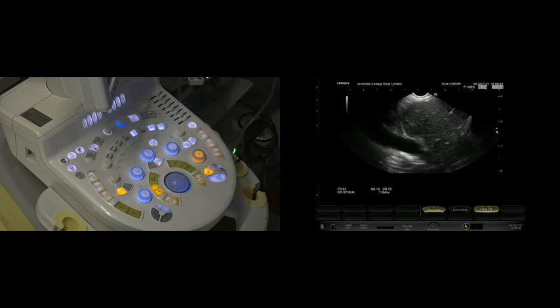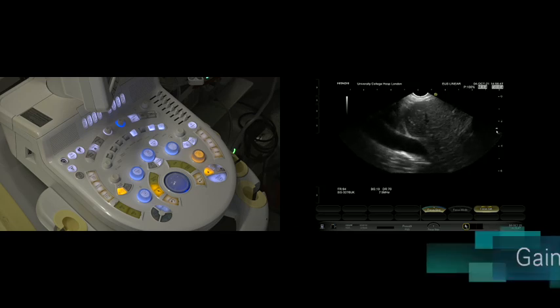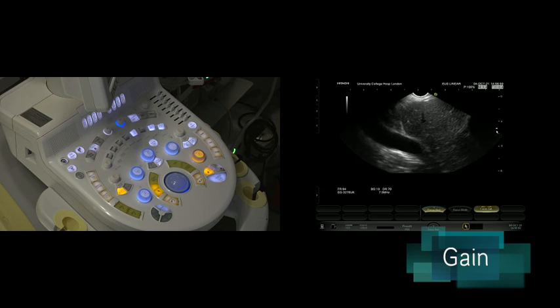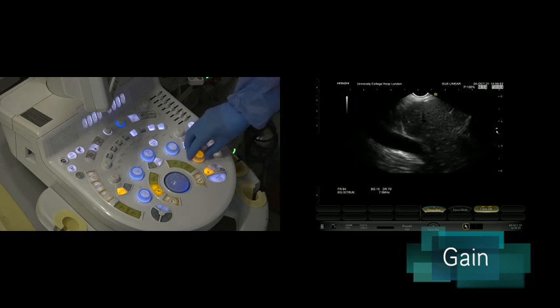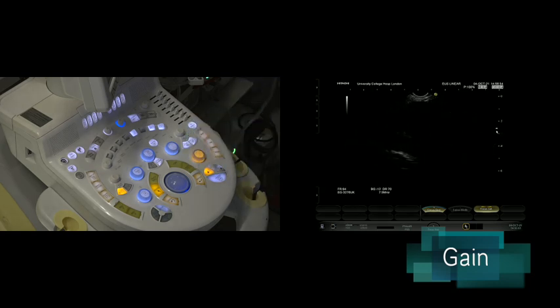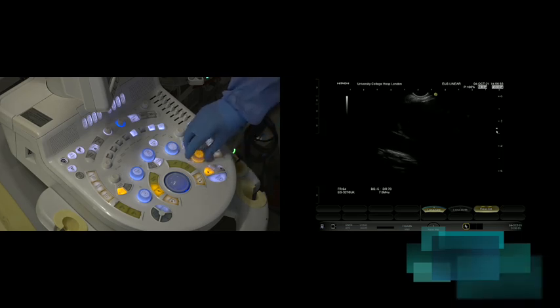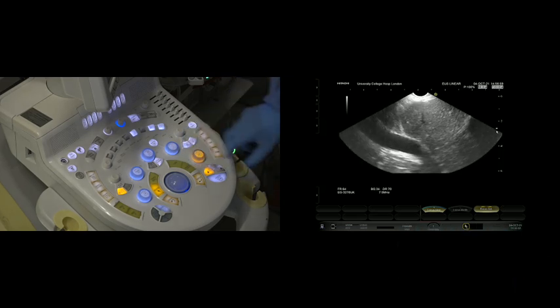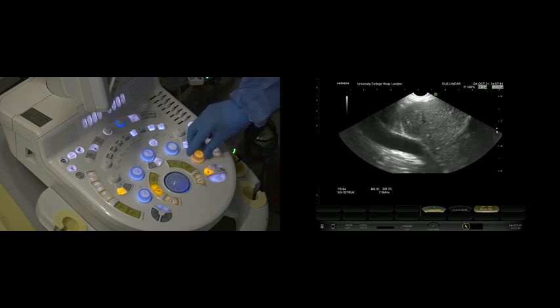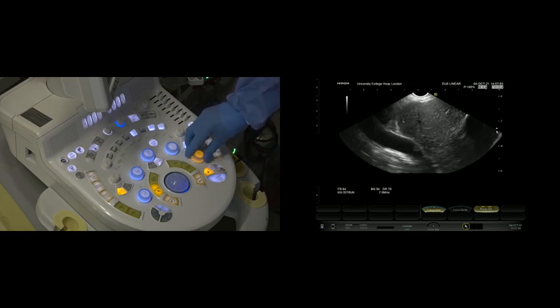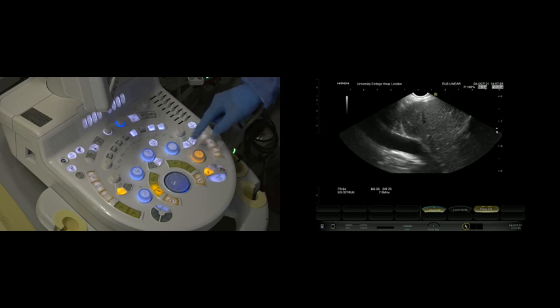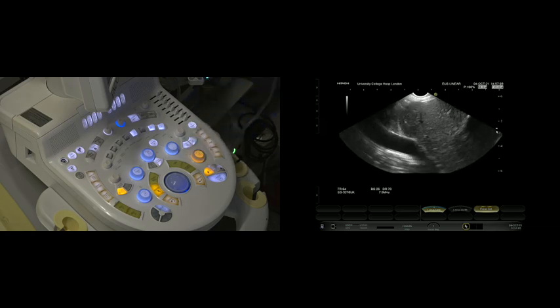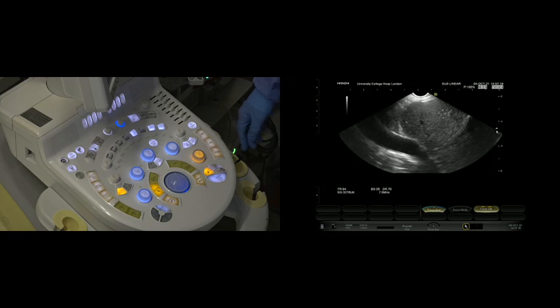The second important thing is the gain. If you like, that's the volume of the image. So we can turn the gain right down, can't see very much, or we can turn the gain up and then it's too bright. So you want that to be in a nice neutral black-and-white image. That's the important one, and that's the gain here.